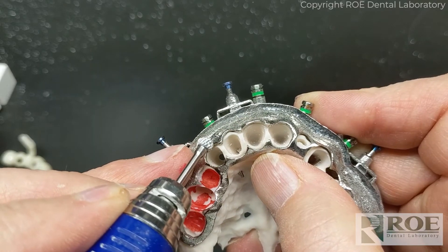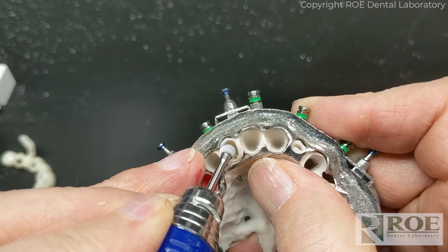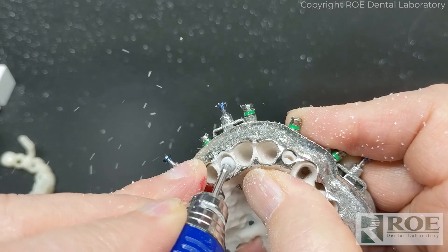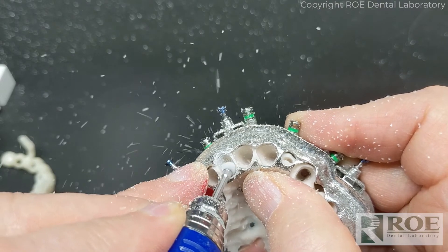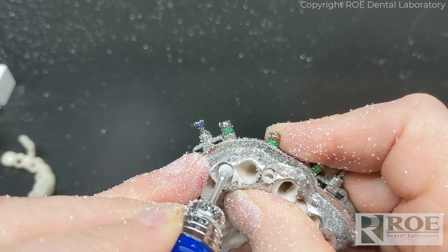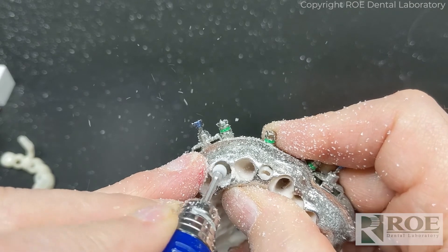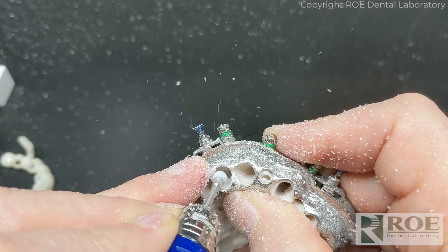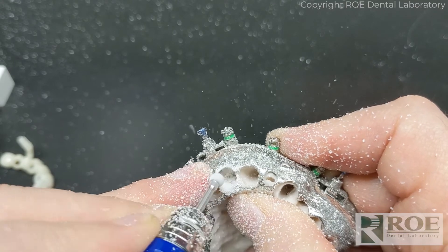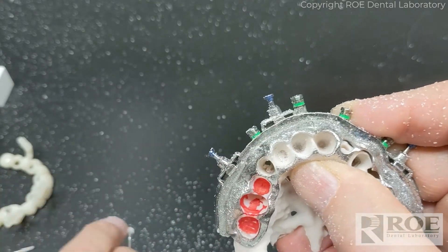The prosthetic on the patient's right side in the seven and eight area has been adjusted to where we need it to be. I'm going to go now and open up the footprint of the bone where these teeth fit, and at this point hopefully the prosthetic will feed into place. It might still be holding up on the patient's left side of the arch, so we'll have to go in there and relieve some of that before everything goes down in place.